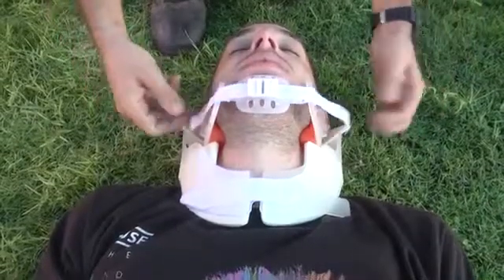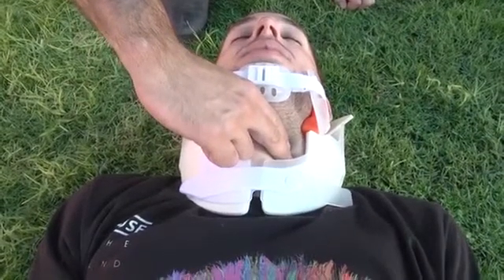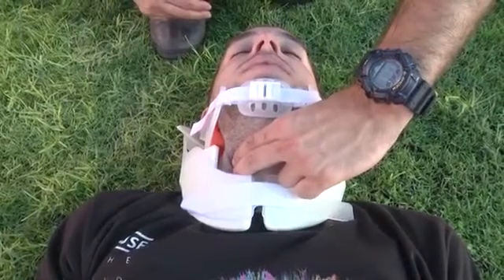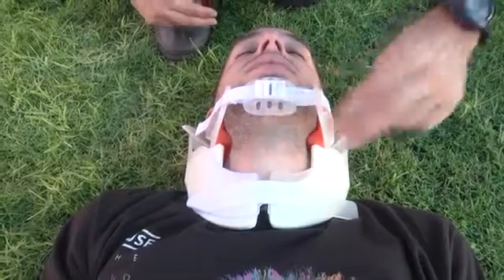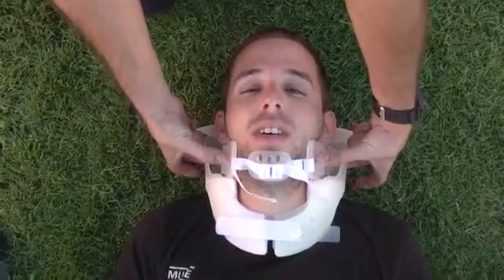Once finished with the procedure, fasten the straps on the patient's chin. Once it is done, you can check for pulse. You can release the chin holder to perform advanced airway, and you can palpate for the carotid and perform surgical airway if needed.